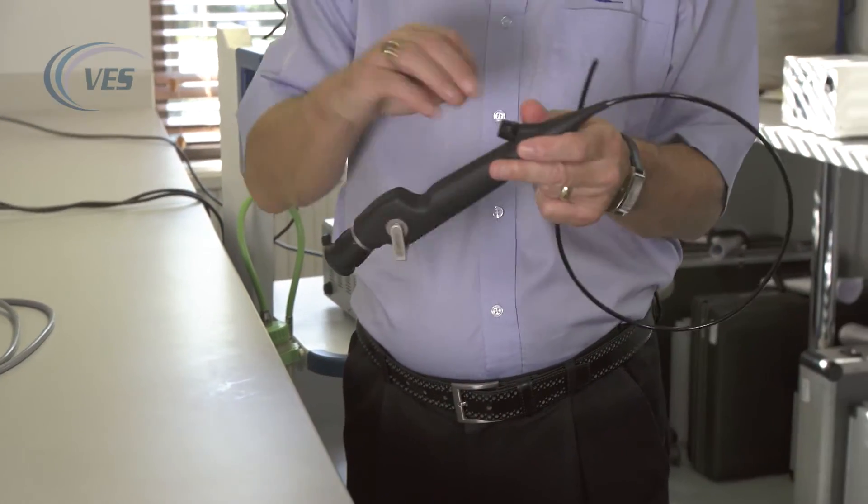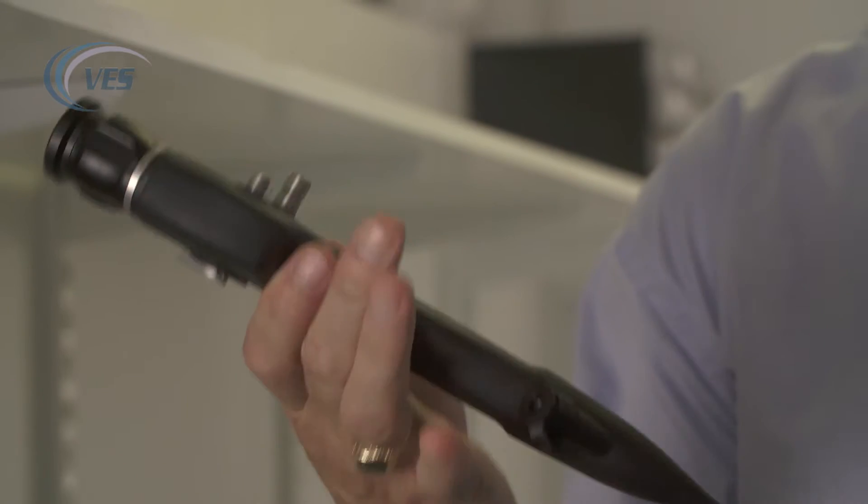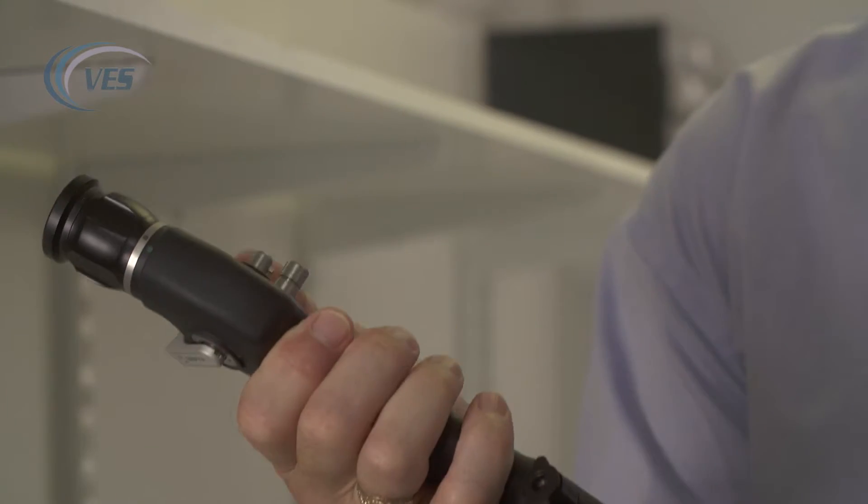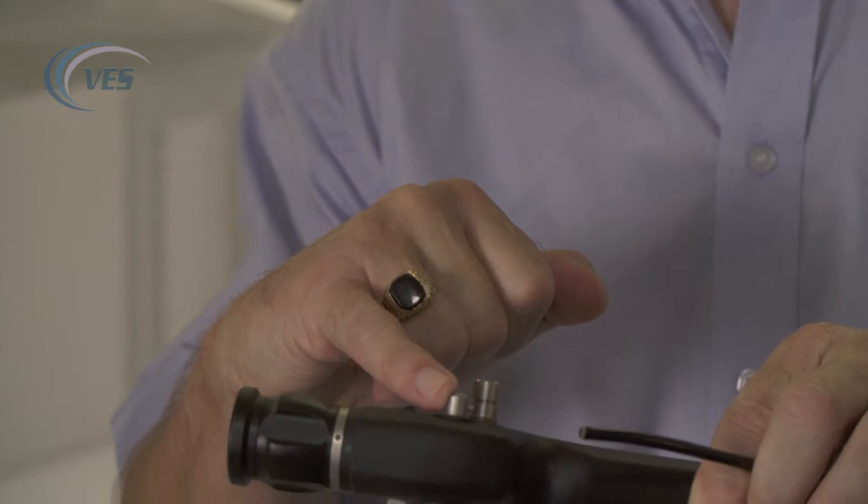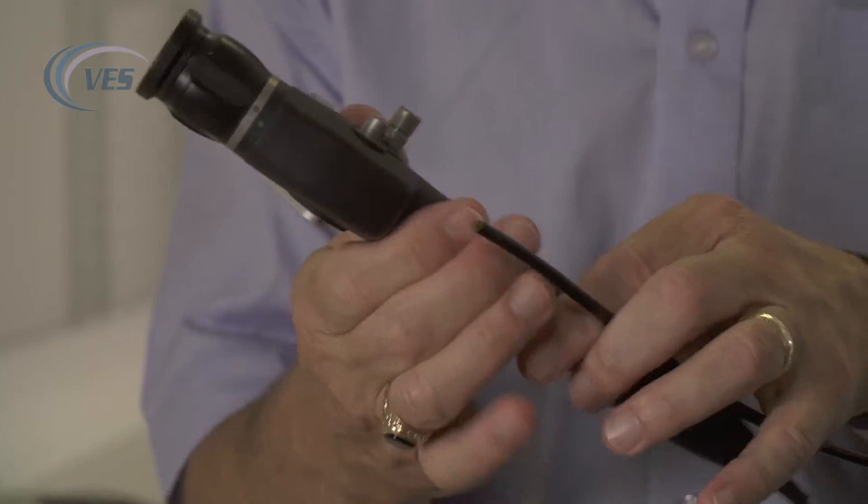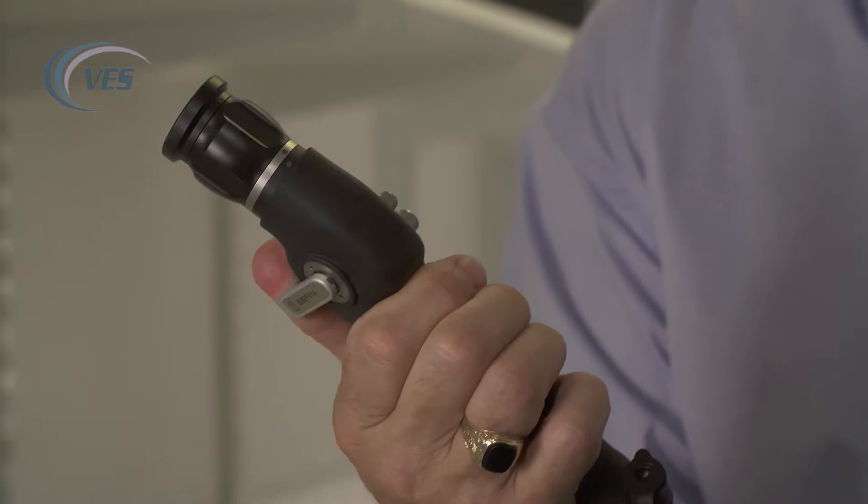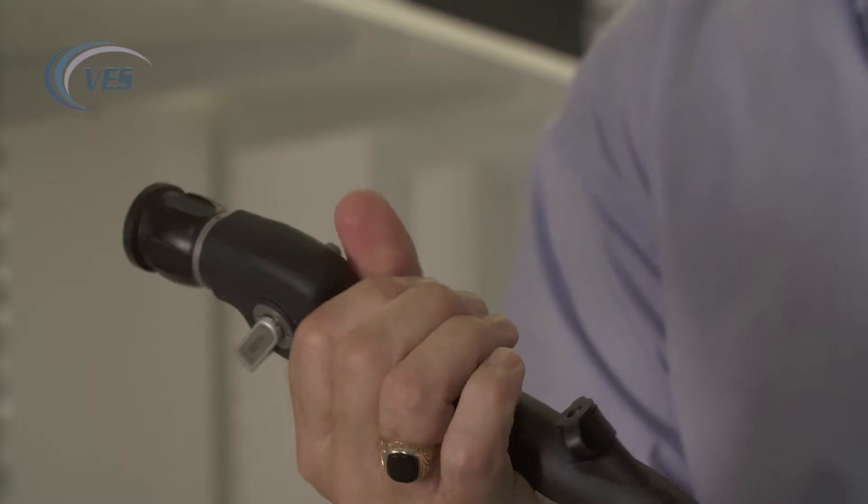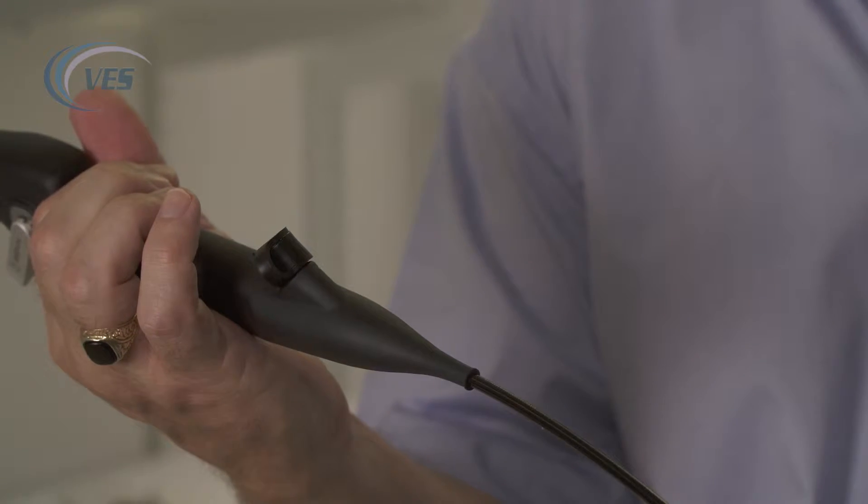So here we have the bronchoscope, and the functions of the bronchoscope are as follows. Here you have your control body, the eyepiece, the leak tester post, the light guide post, and the controls for moving the distal tip on the end of the scope. And here we have the biopsy port for putting through your cleaning brushes and your biopsy forceps.